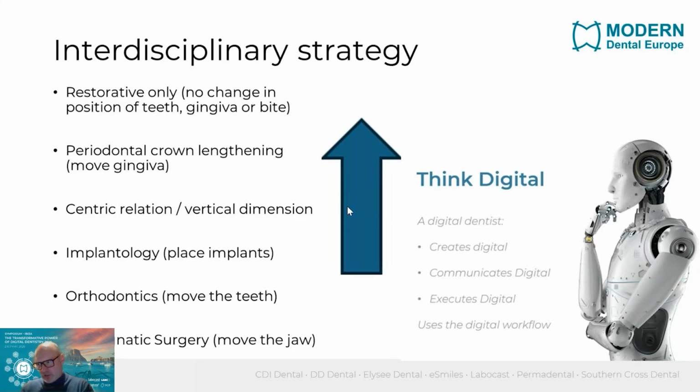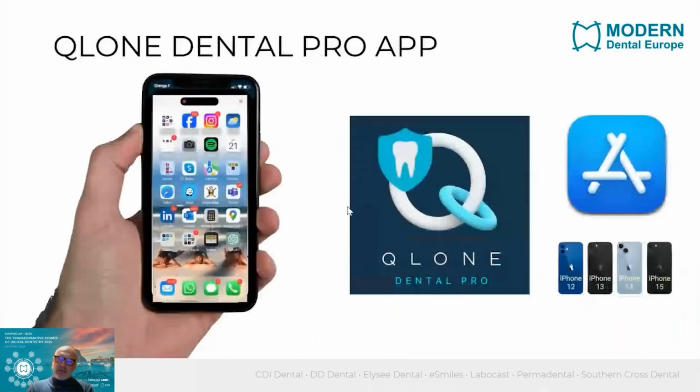And this is a tool which really helps us finally come from the CAD, the design, towards the manufacturing, the CAM, so after approval we can convert to CAM, which means execution, production, and finally milling or printing or whatever to produce the final solution.